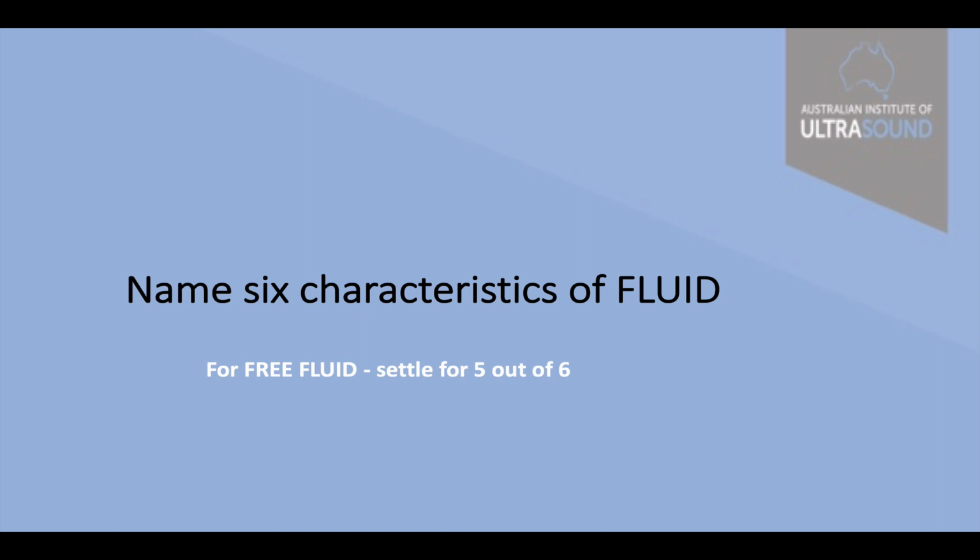So for me, first of all, I look for black bits. But if they're not black, it doesn't entirely rule out free fluid. I look to see if they obey gravity, if they conform to the shape, whether it's the inside shape or the outside shape of the container. I look to see if there's any independent movement of particles within, movement that's dissynchronous with the deforming force.